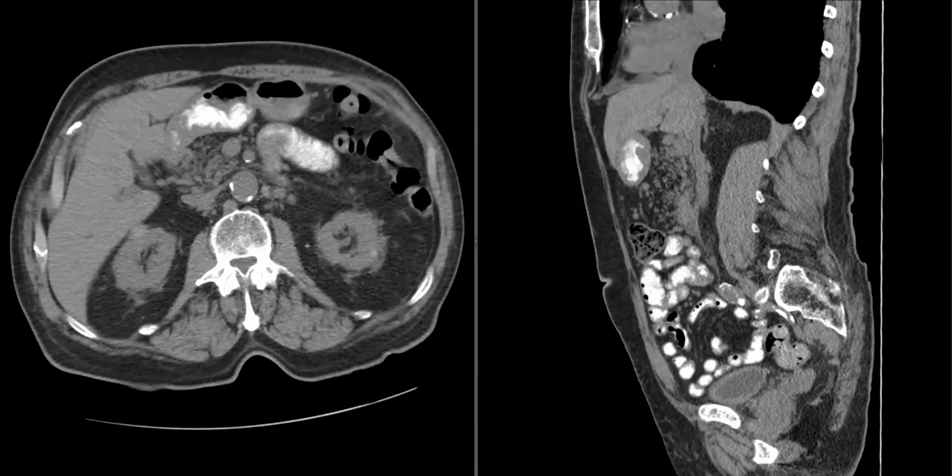Okay, I'm going to stop share and then let Jonathan show his case while I pull up my next case. Nelly, I also have cases. Can you see this? Yes. Perfect. I love that you use Visage too, so you can guide me sometimes. Okay, so you ready? Yes.